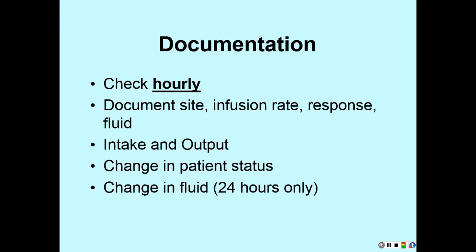No more than every 2. And of course, if you have a vesicant infusing, you've got to check it every hour. Your policy may even say every 30 minutes. A vesicant, that caustic stuff that we talked about.